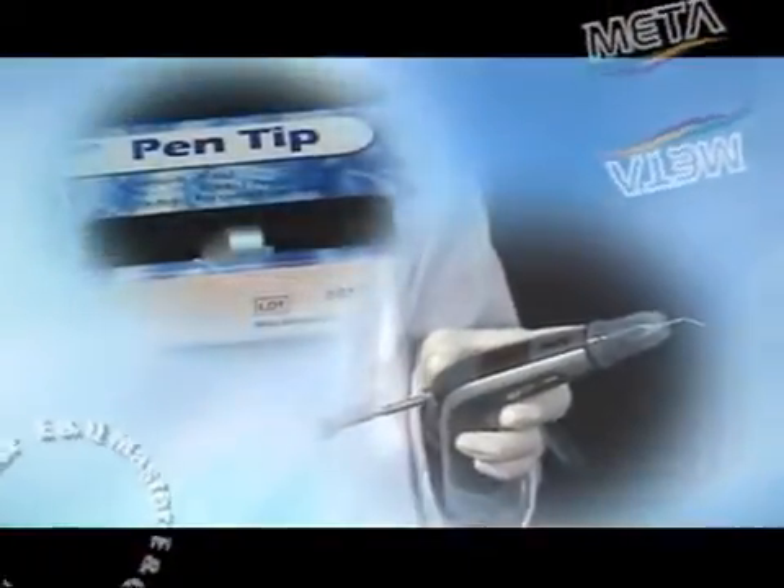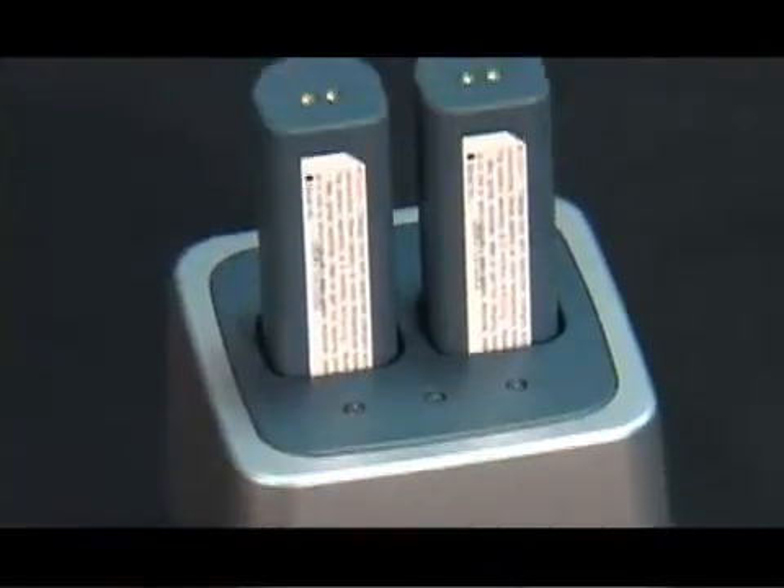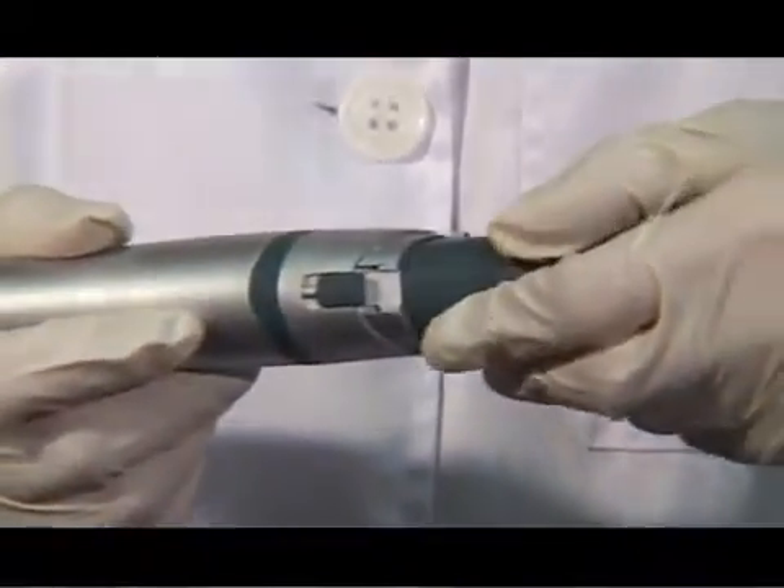These are the featured advantages of E&Q Master. It is convenient to use with a cordless battery charge method, similar to that of cellular phones. You can replace an exhausted battery with an extra charged battery during use.